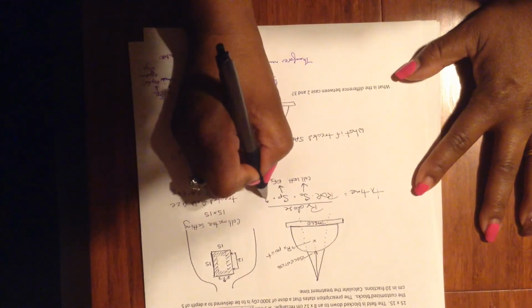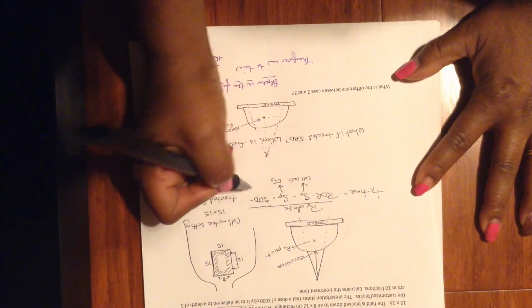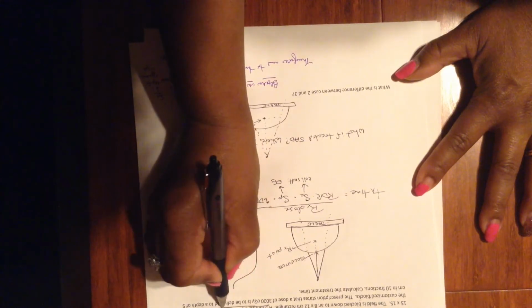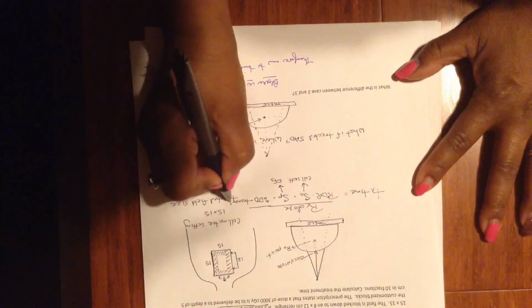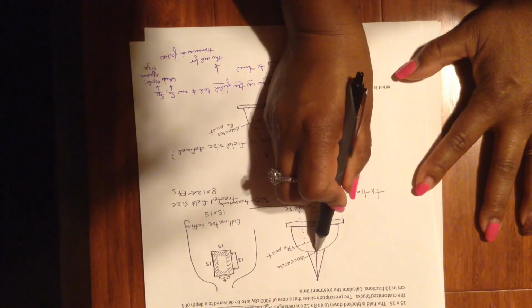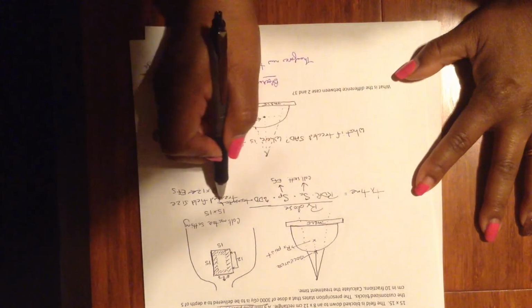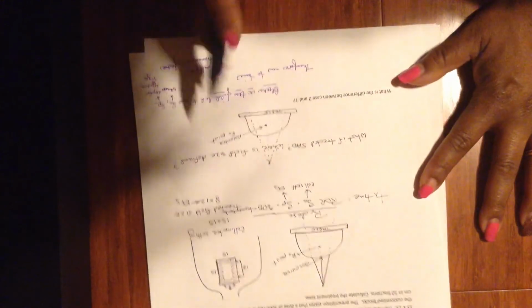Then we're going to need percentage depth dose because this is SSD. And then this time we're going to need an attenuator or transmission factor because there's a 5 millimeter solid plastic tray. I'll let you look this factor up. This is true SSD. Isocenter is here on the skin, so we don't need inverse square correction. So this is how this looks different than the first case.